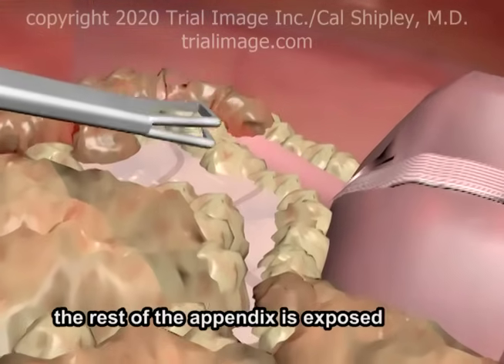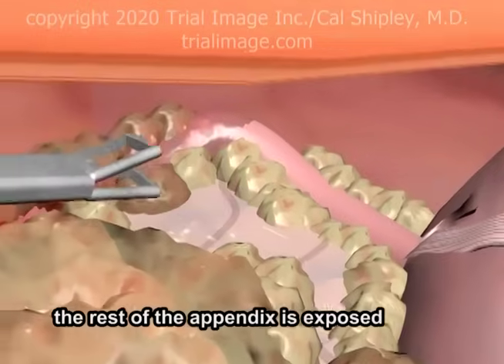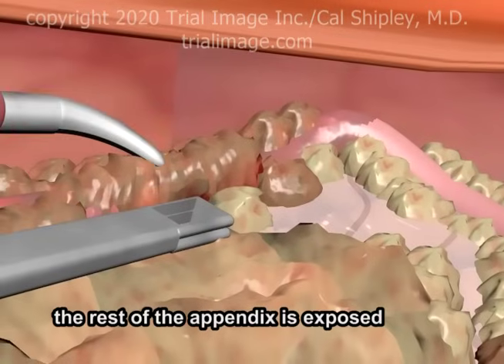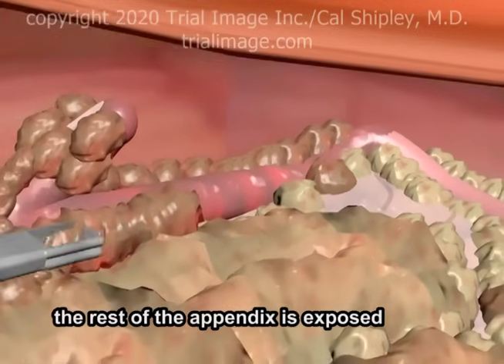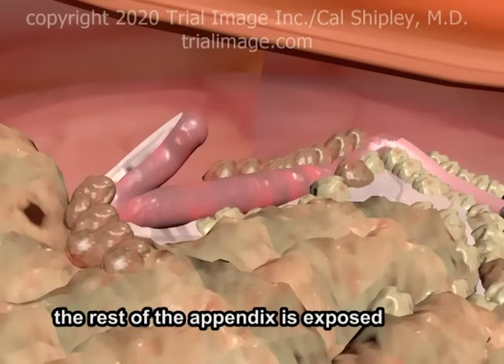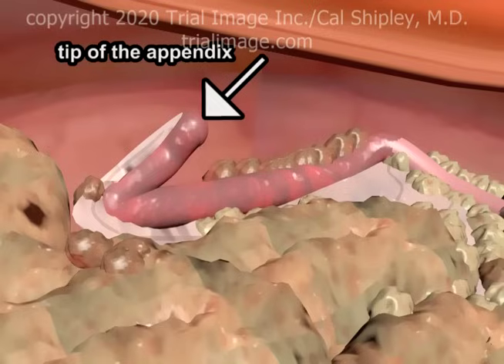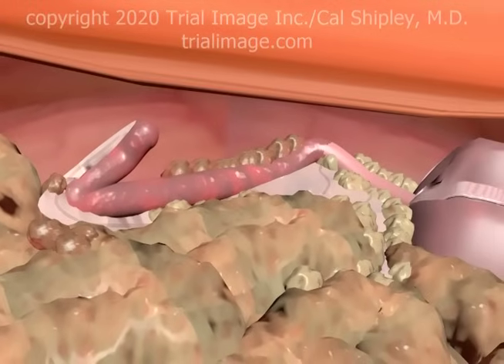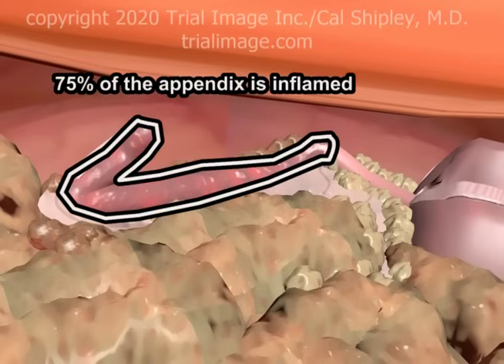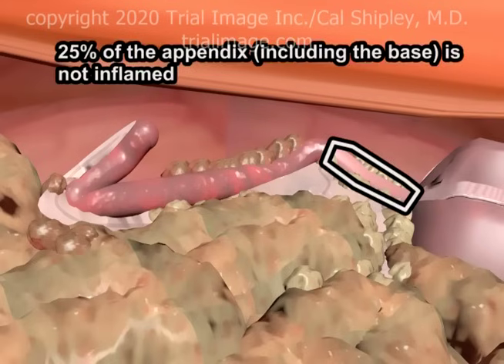Once the base of the appendix has been exposed, the surgeon systematically exposes the rest of the organ to its tip. At the completion of this dissection, the appendix can now be fully visualized. In this example, about 75% of the appendix has become infected and inflamed. About 25% of the organ, including the base, is normal.